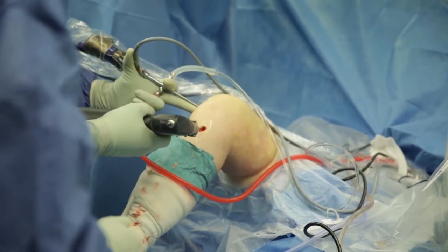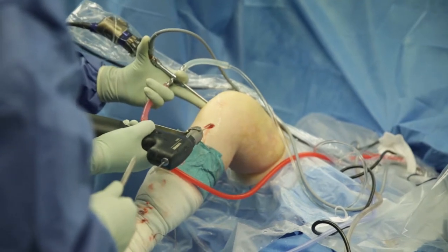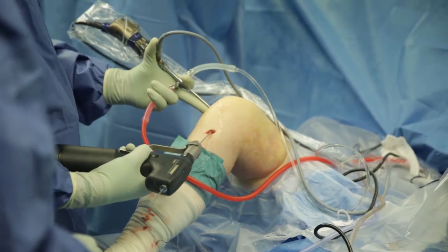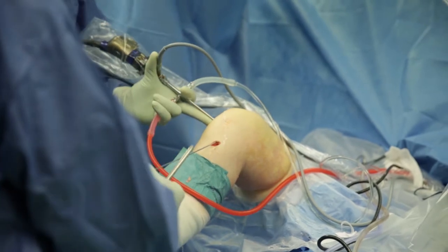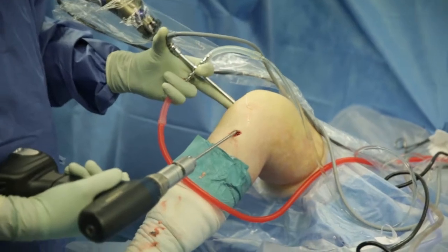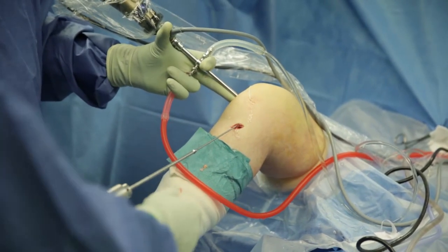We try to find the old channel with this K-wire. You see, we try to find the old channel anatomically guided, and you see as the K-wire is wiggling that we have found the old channel. So now stepwise drilling of the old channel.